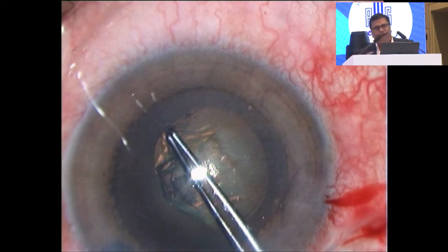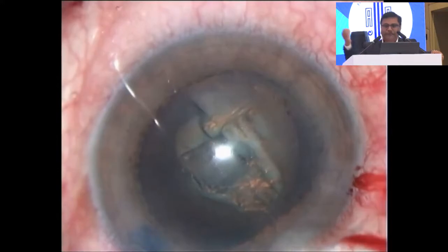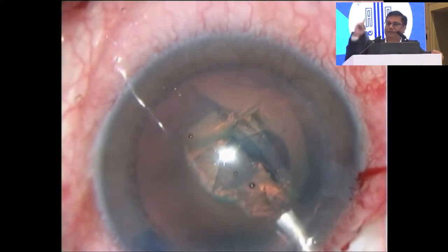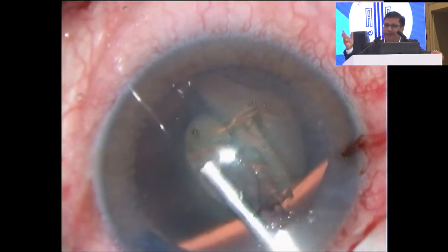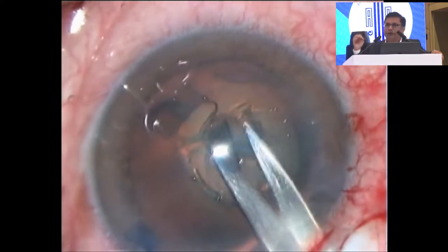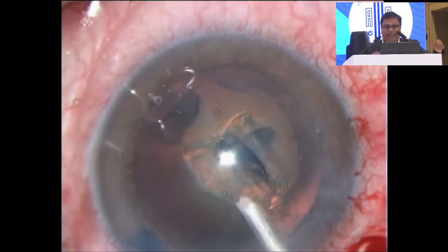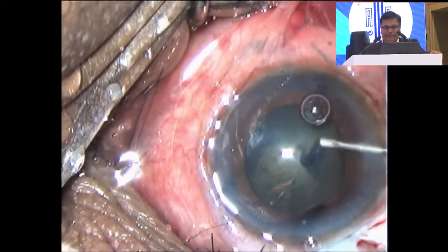Then second, what are the instrumentations needed to manage this runaway capsulorhexis? And still when you manage, you should know certain principles: how to tackle it, how to do the phaco after that. So this is the very slow movement. See, sometimes even with slow movement the capsulorhexis runs away. So in my first book I have written one chapter, 2-3 pages, on what should be the speed of capsulorhexis at certain points, and when this is the direction of capsulorhexis, it is difficult.